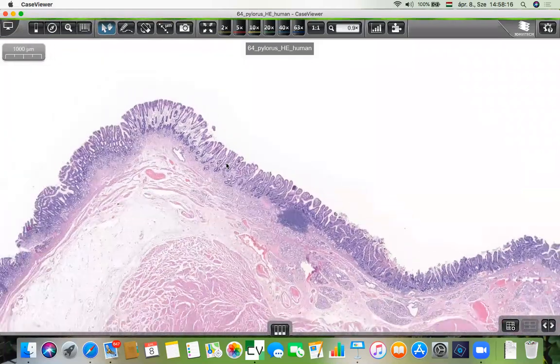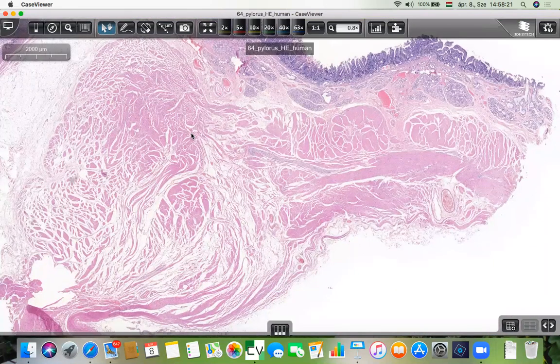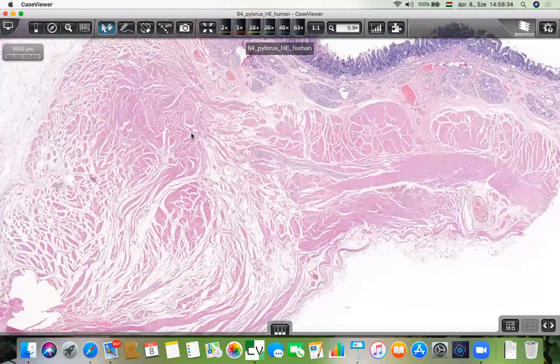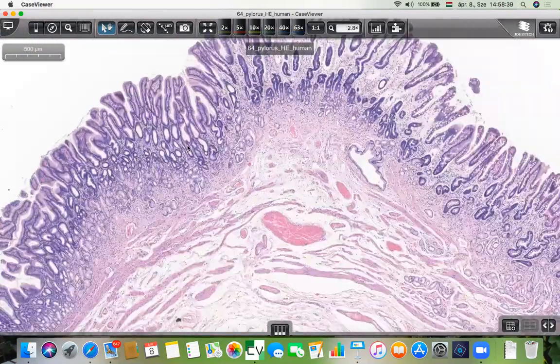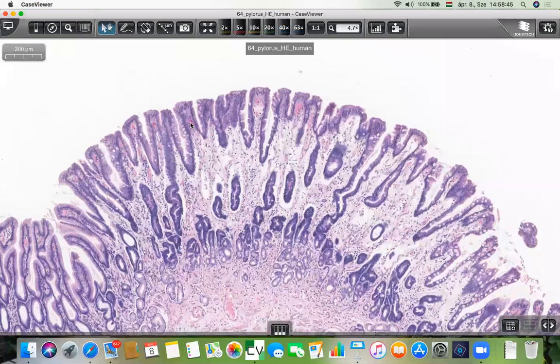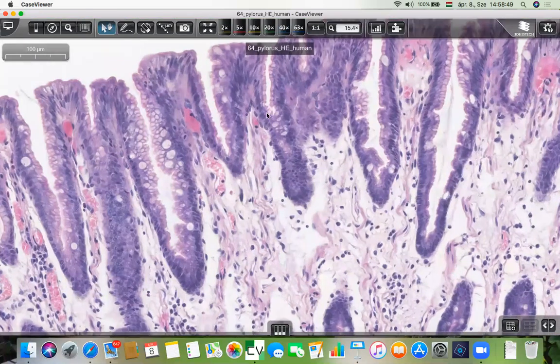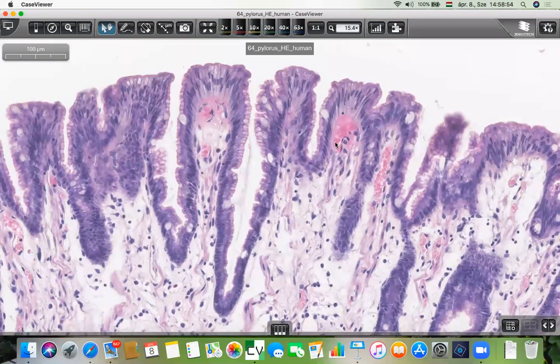Do you have any questions? Everybody knows everything. I have a question. When you zoom in to the upper part, there were some pinkish structures all the way to the top. Are those blood? Blood, just red blood cells. Okay. Thank you. Other questions?